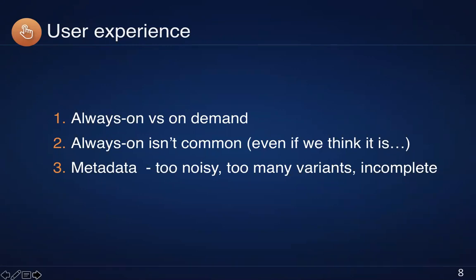So to expand on that, when we run our triage on every head CT study, the question of what exactly is every head CT study in your organization is a very tough one. The reason is that the metadata, which should be the machine-intelligible part, is actually very noisy and highly variable.